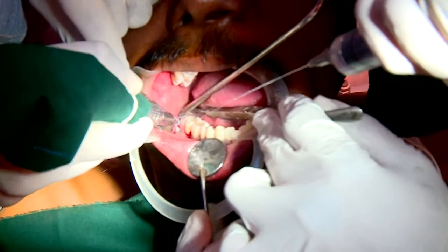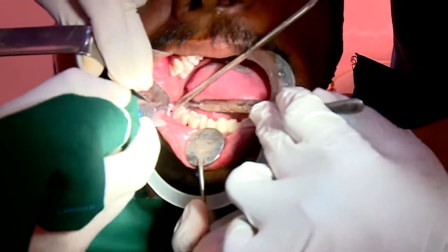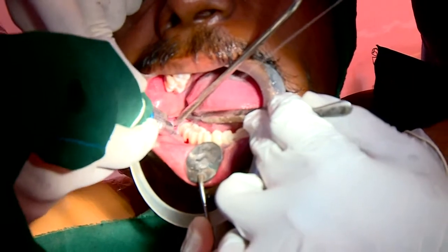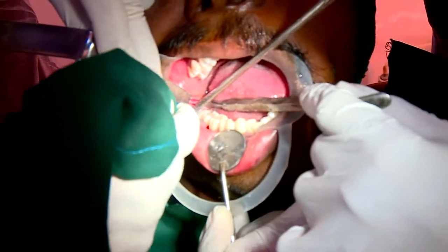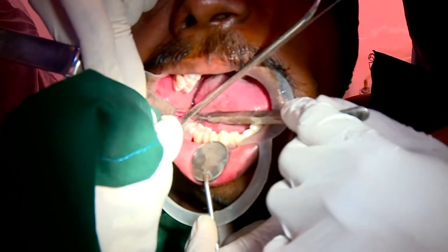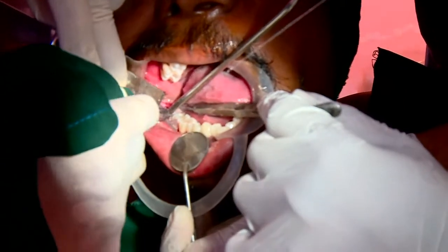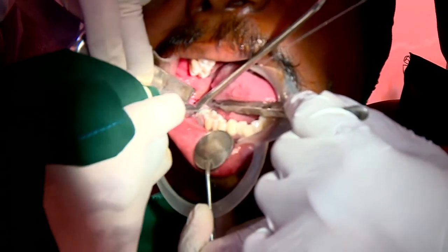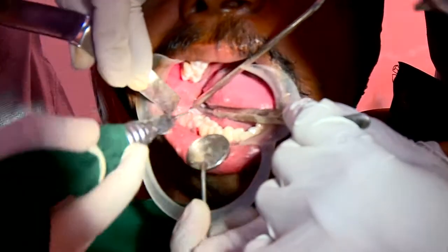Always take your time while using the tool, because there is a lot of tooth structure that has to be split.